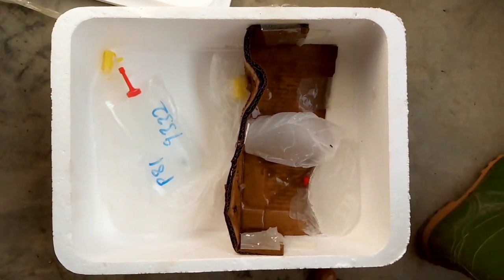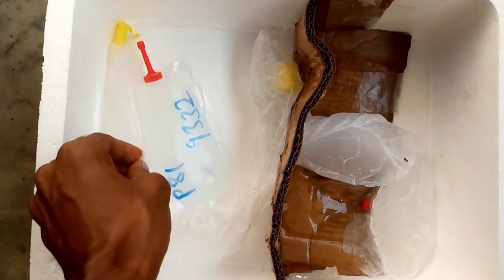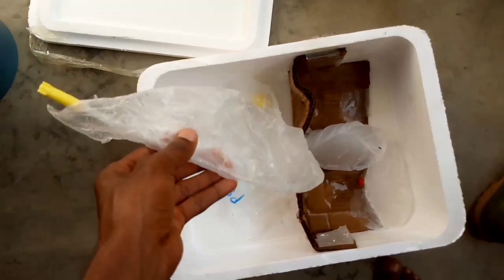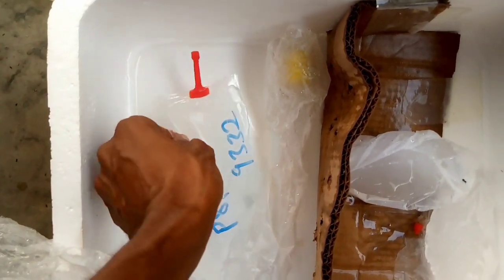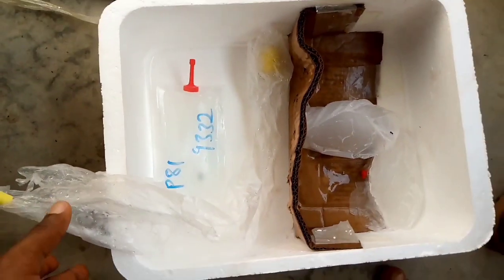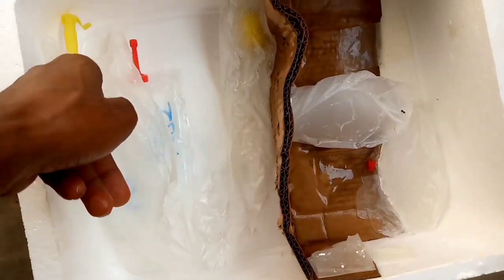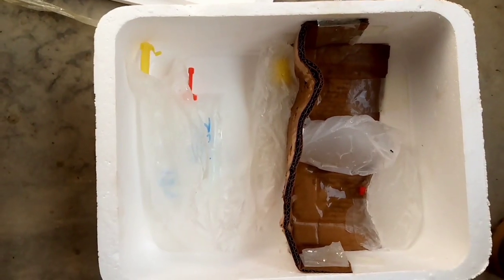These are the things that we use for activation and insemination. We have our catheter here — this is the catheter we are going to use — and this is the semen. I ordered it and it came delivered in this flux container with some ice blocks around it. These are the things we are going to use for our artificial insemination.